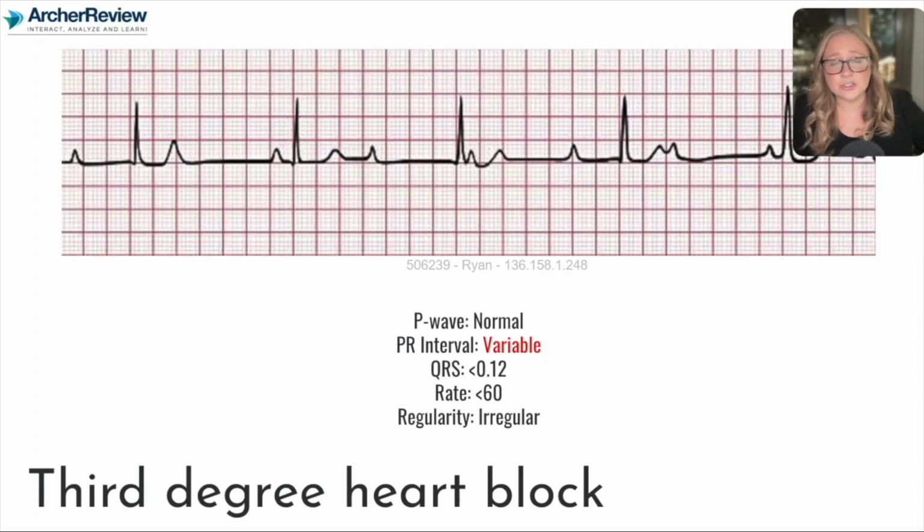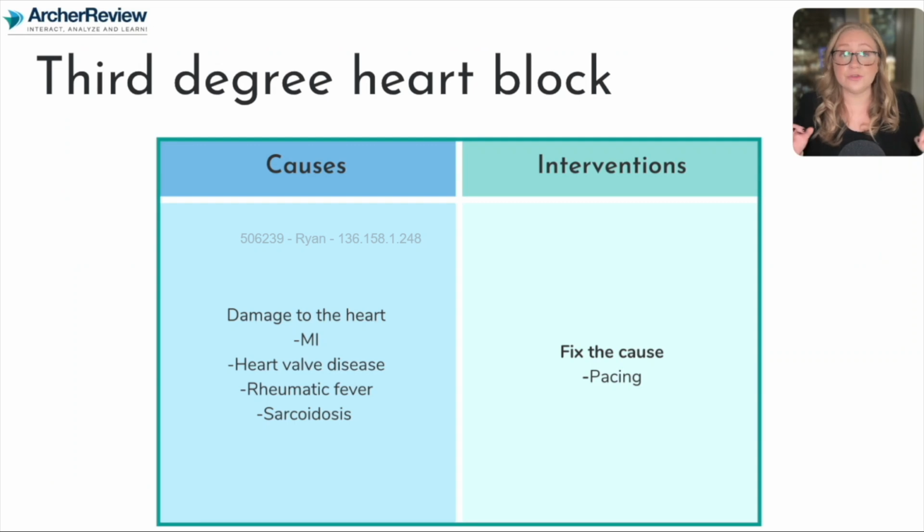And as I mentioned, third-degree heart block is a big problem. This client is not going to have sufficient cardiac output to perfuse their vital organs. So we consider this a potentially fatal rhythm. And for that reason, we do need prompt intervention.